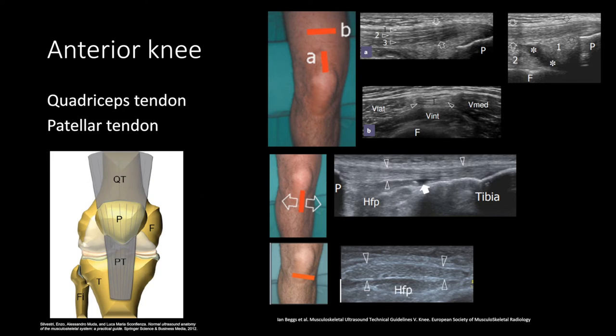The main structures to look at are the quadriceps tendon and the patellar tendon. Position the knee so that it is slightly flexed to stretch the extensor mechanism. The quadriceps tendon is four muscles forming three layers: the rectus femoris, the vastus lateralis, the vastus medialis, and the vastus intermedius, forming the superficial, intermediate, and deep layers. The superficial layer labeled number one comes from the rectus femoris, the intermediate layer labeled number two from both the vastus lateralis and vastus medialis, and the deep layer labeled number three from the vastus intermedius. The top rightmost image shows a long axis view of the distal third of the quadriceps tendon. The asterisk denotes the suprapatellar synovial recess, number one the suprapatellar fat pad, number two the prefemoral fat pad, and the empty arrows indicate the quadriceps tendon.